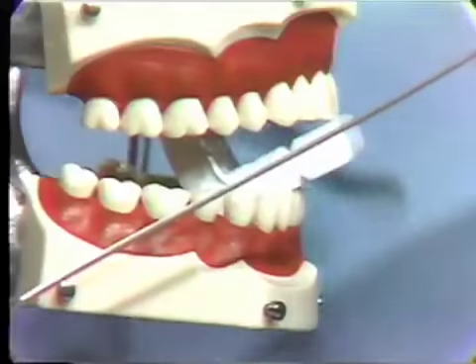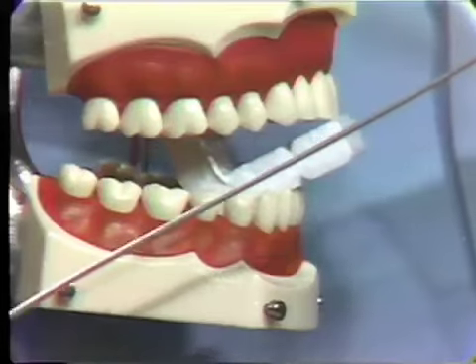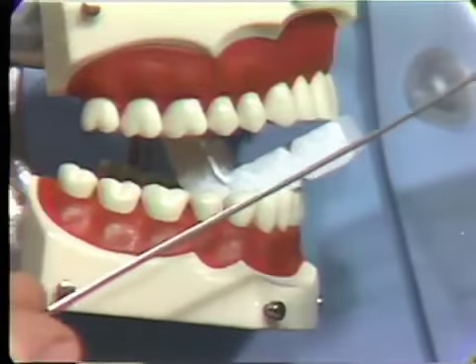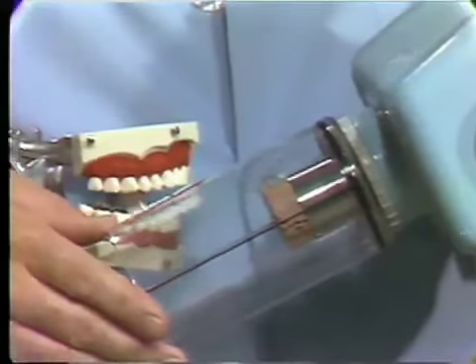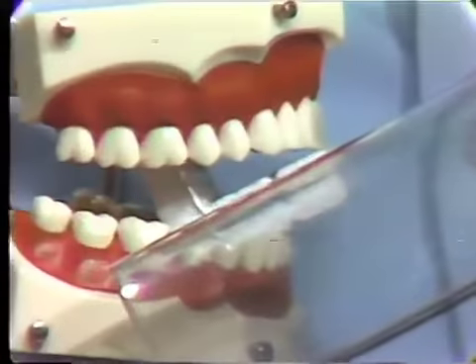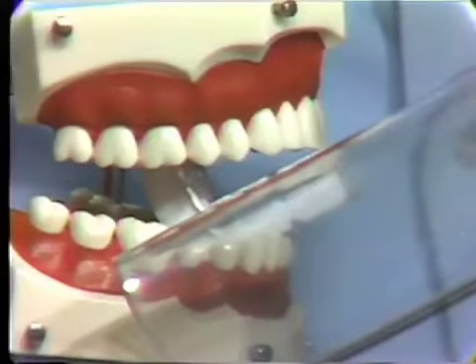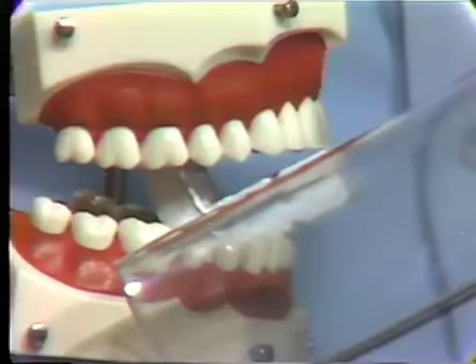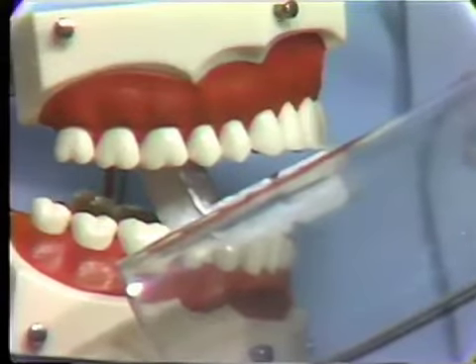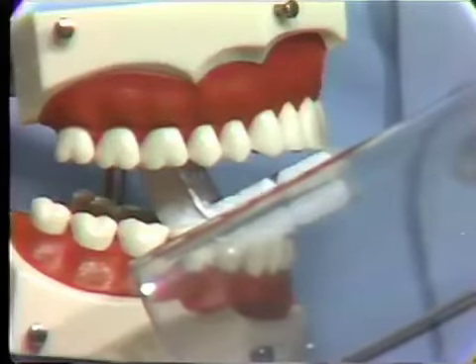block. But unfortunately, we don't have a visible central ray to do this with, so we have to use instead the cone of the machine. So I am going to utilize the top edge of the cone. There you can see the top edge of the cone and the top of the block are lined up parallel. We can see an even, uniformly wide strip of white block showing above the cone. This is how we have determined the vertical angulation.